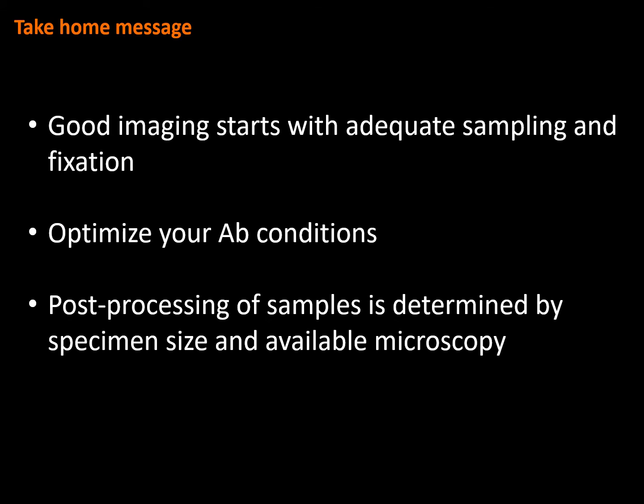Finally, as a take-home message, I would like to leave you these three notes: that a good image always starts with adequate sampling and fixation. You have to optimize your antibody conditions all the time, because fixation changes. Your species might be different from the ones where the antibody was first generated, and you have to optimize for those particular conditions.